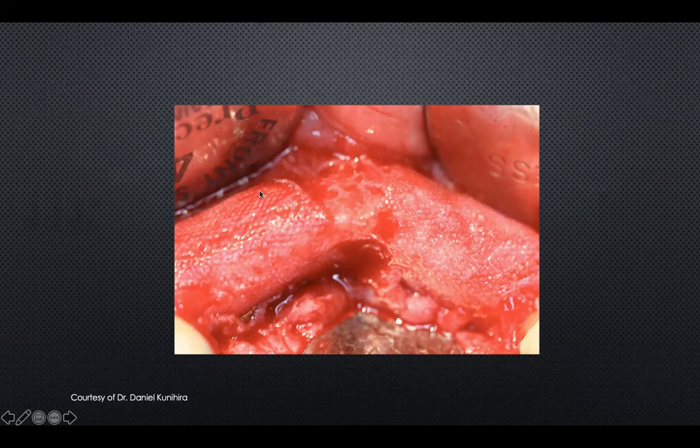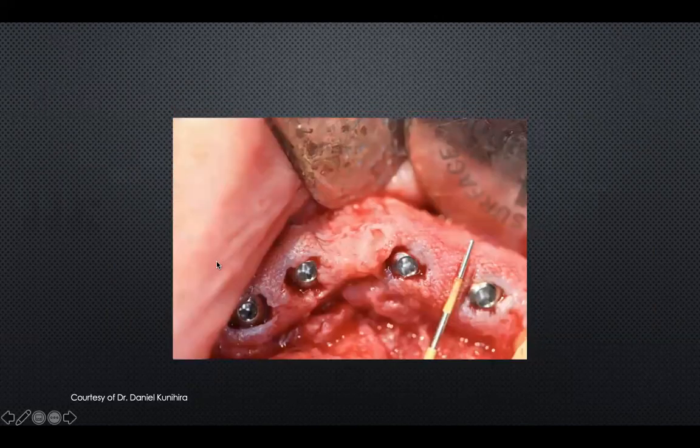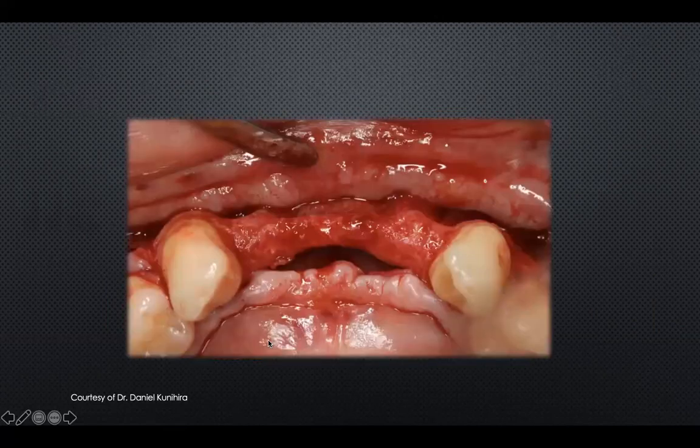There is a soft tissue layer of pseudoperiosteum. You can leave it here, no problem at all. It's filled with blood supply, and you can do your implant osteotomy through that, and you can appreciate the thickness that we gained. And that's pretty much it.